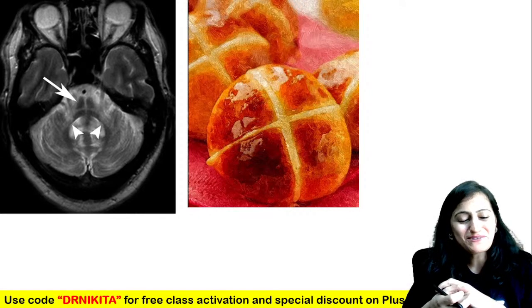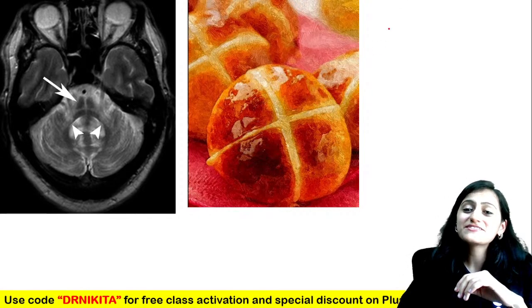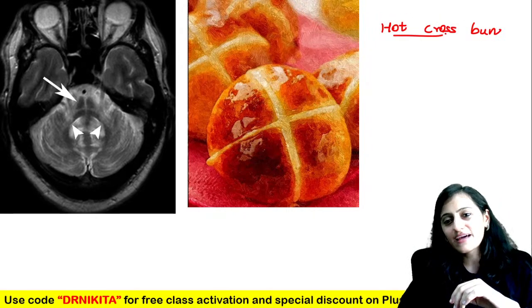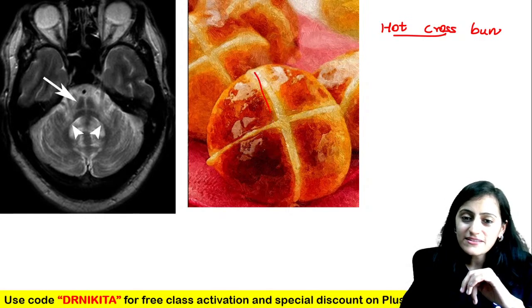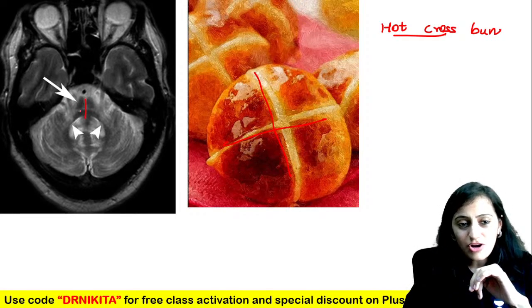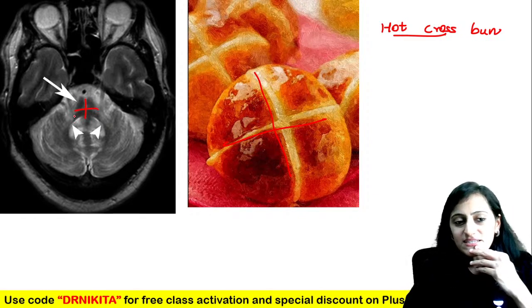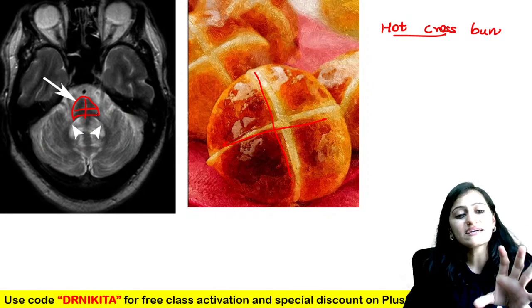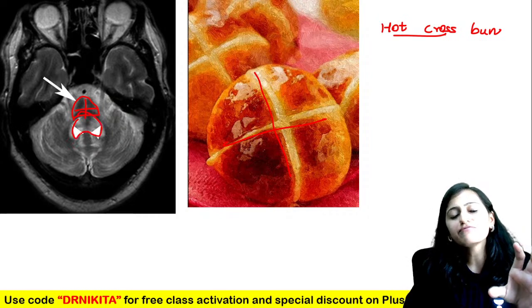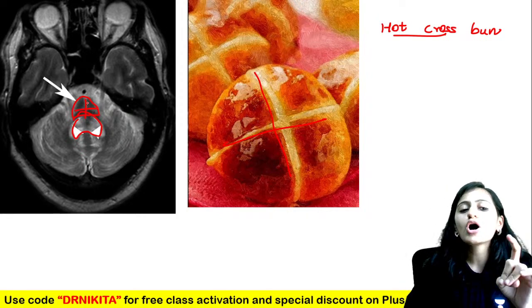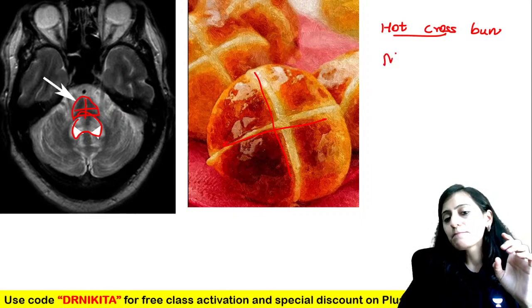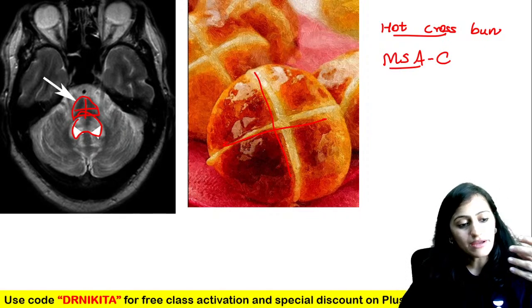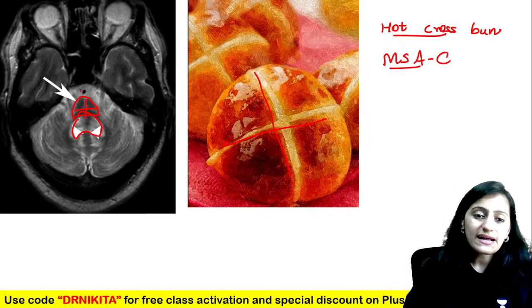This is the hot cross bun sign — you see a cross appearance in the pons. I call it pons because behind it I'm seeing the cerebellum and fourth ventricle. Hot cross bun sign is seen with multiple system atrophy cerebellar type — MSA-C.